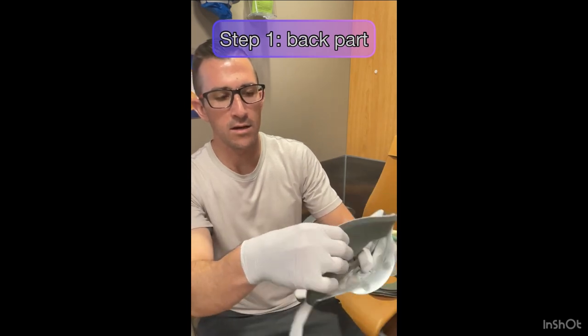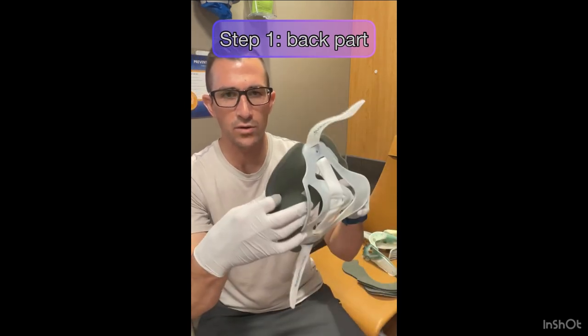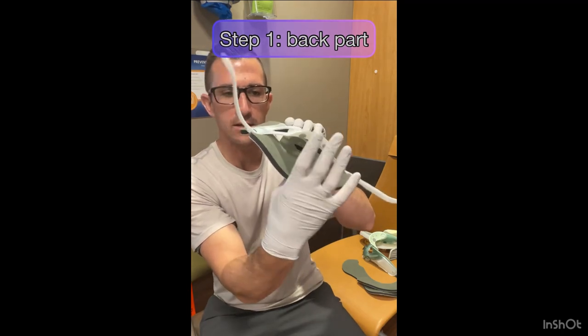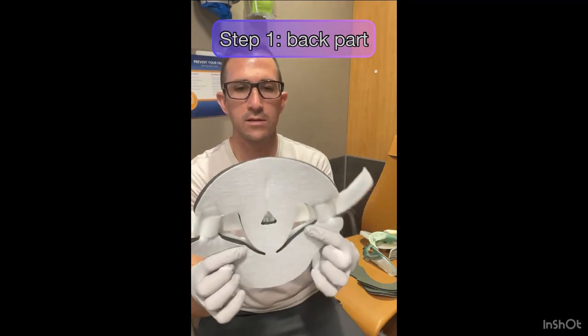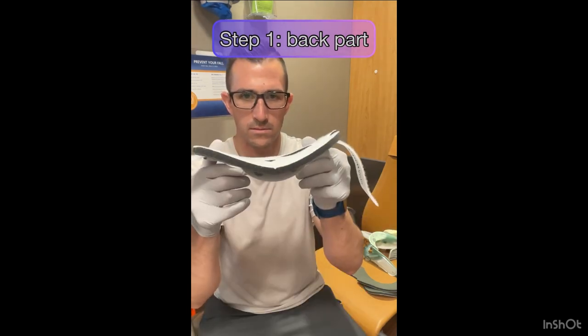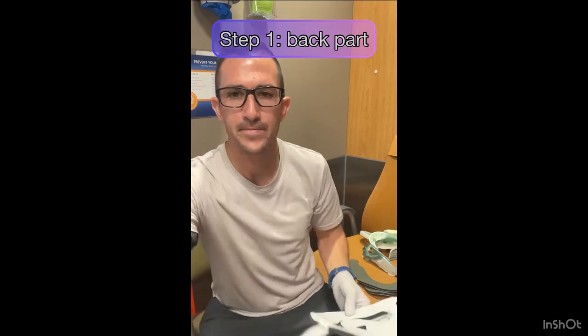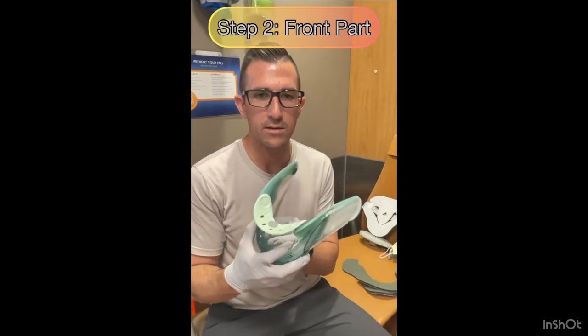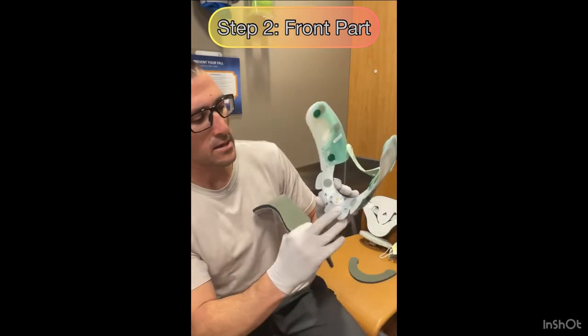The pad on the back is now on. All I've got to do is pull it off the velcro and then push it so that it's nice and firm and flat on that back part of the brace. Now let's move on to the front part of the brace.